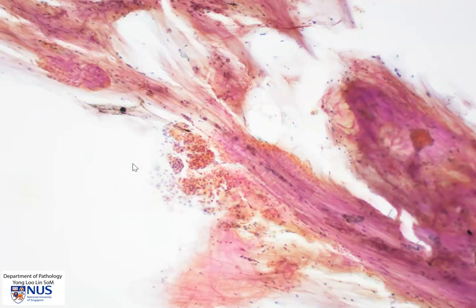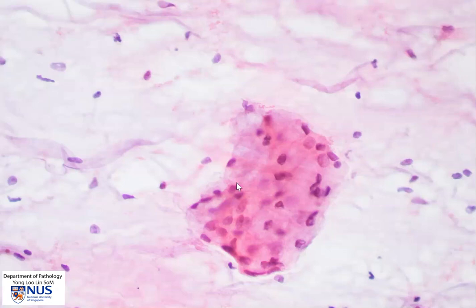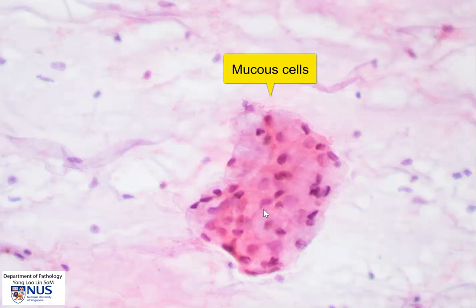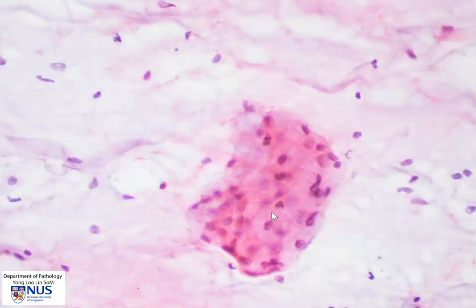It is because of the hypocellularity that this may potentially be mistaken for a mucocele or other non-neoplastic lesion. At high magnification, we can see a cohesive sheet of mucus cells. These cells, if occurring singly, can closely resemble macrophages, but we can see that they are cohesive.